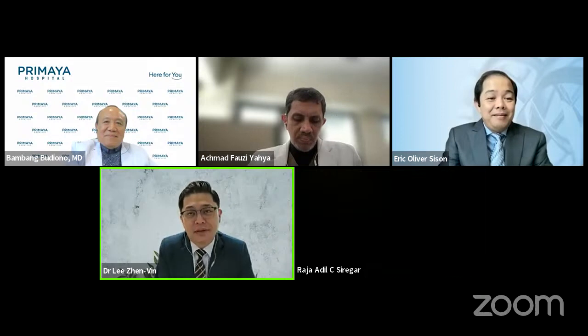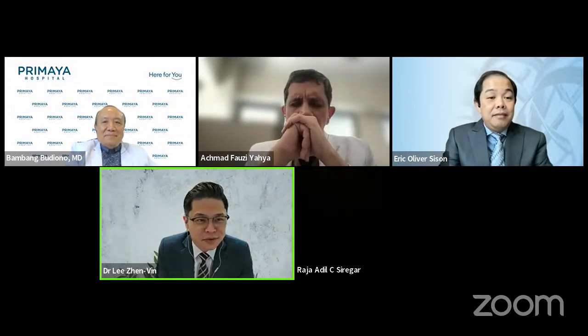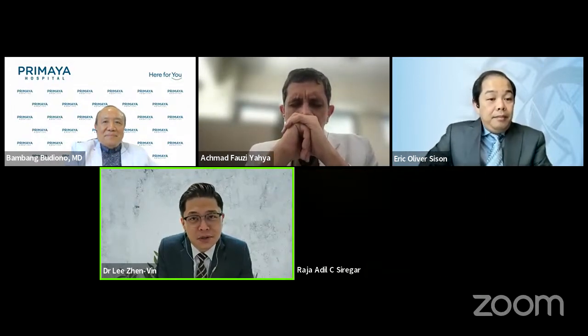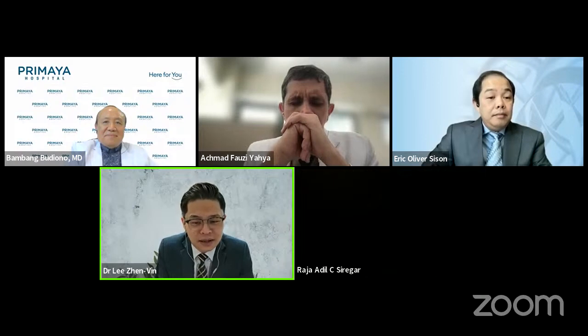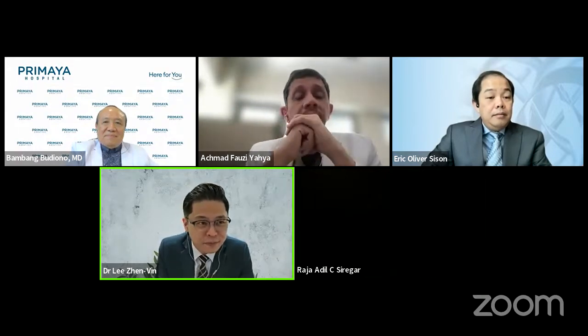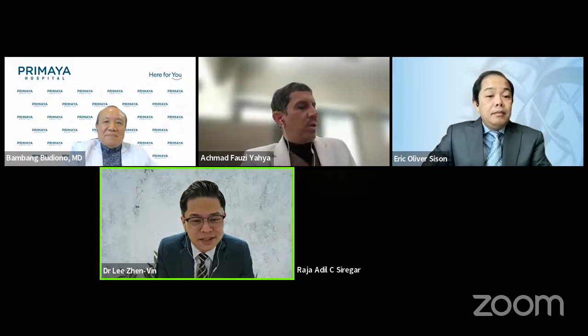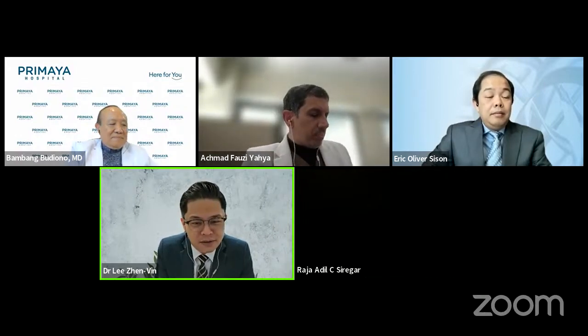I fully agree with all that you've mentioned, especially the part where intracoronary physiology and imaging are both complementary to one another. I just have a question for you. On the assumption that you assess a lesion and it appears to be significant, at the end of the day, personally I'm a believer of function. How about yourself? Do you utilize the functional assessment as the tiebreaker to decide whether this patient should undergo revascularization, or would you use intravascular imaging instead?